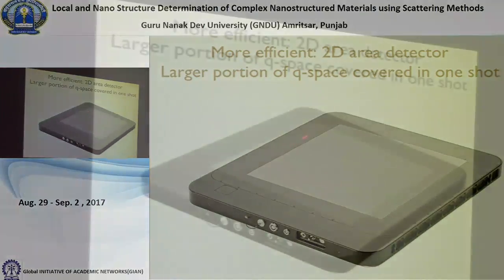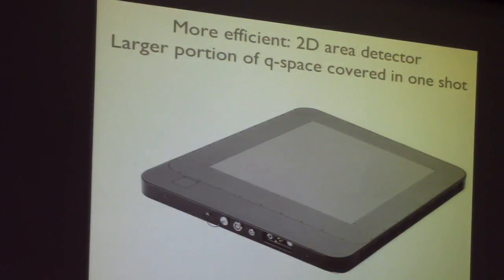So this thing is basically pixelated. It's not using the photomultiplier tube, which is a big thing. It's doing the gaining electronically, with chips on the backside. These things are now very large, like 300 or 400 millimeters, almost half a meter on each side.